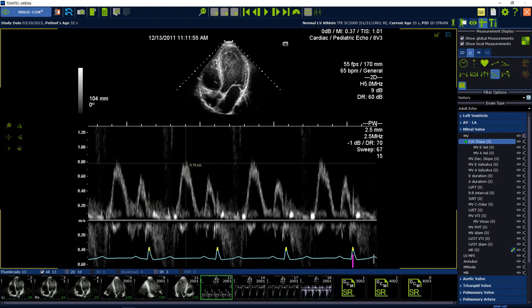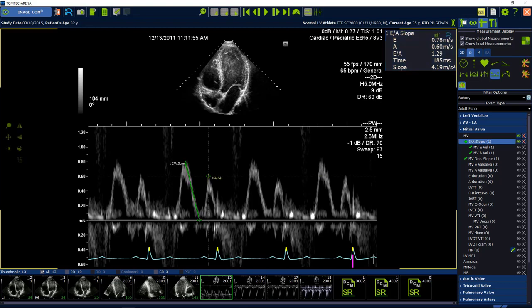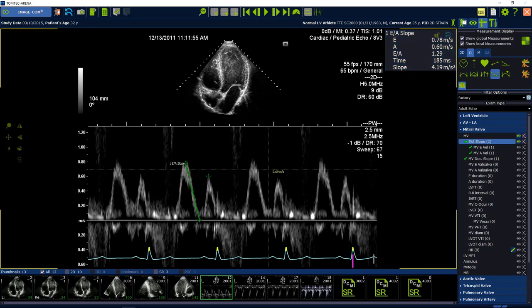Place the first point on the e-peak of the mitral valve inflow and drag the deceleration slope to the right position. Click a second time to confirm the measurement. Place the third point on the A-peak of the mitral valve inflow.